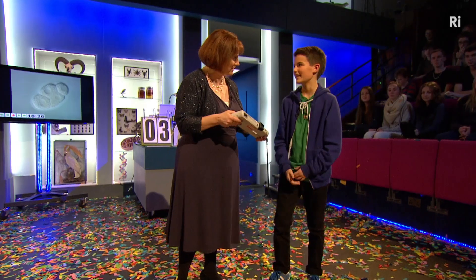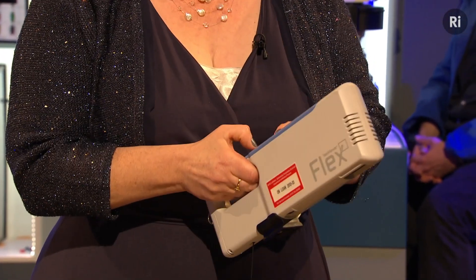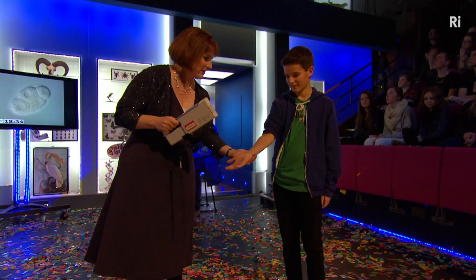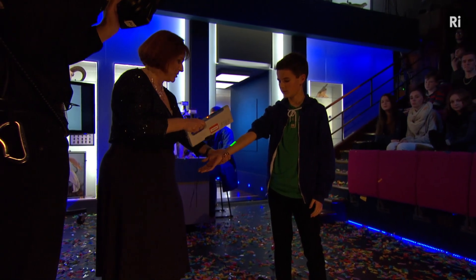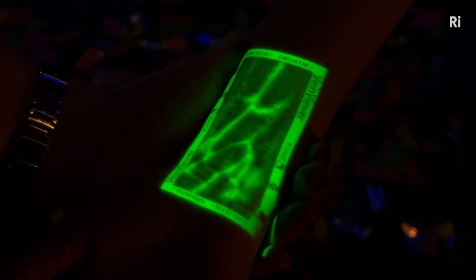So I understand this is a vein viewer. So I guess we're going to be able to view veins. Should we give it a go? We'll switch it on. Can I have a look at your arm? Here we are. With this machine, we can actually look inside Ollie's body without chopping him up, which is just as well, really.